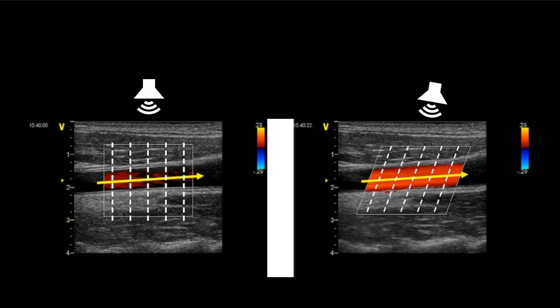So we kept the same angulation of our vessel, but now we are steering and we're creating that oblique incidence on a less degree of angulation between the vessel and the color box. So it's filling nice and beautifully.